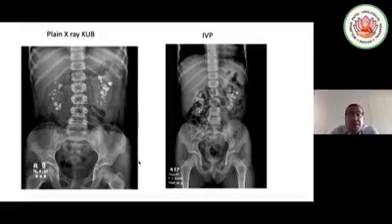Consider that for me, 99.9% of PCNL are supine. So for sure it is, but my final answer should be based on a CT scan, axial images on CT scan. But taking a look at this, it seems a very nice case for supine, and especially for combined.